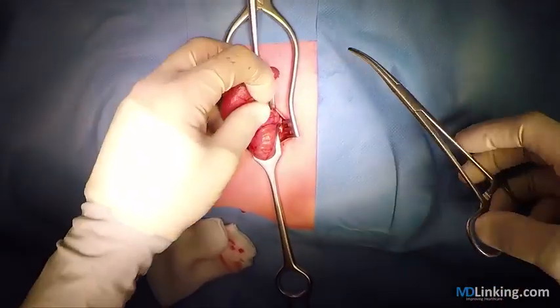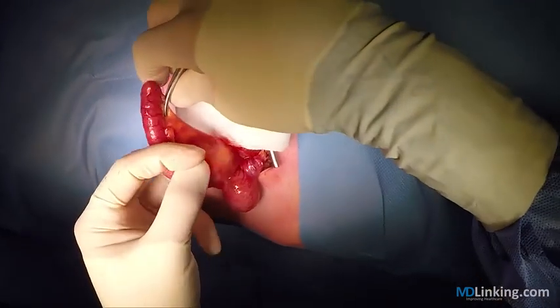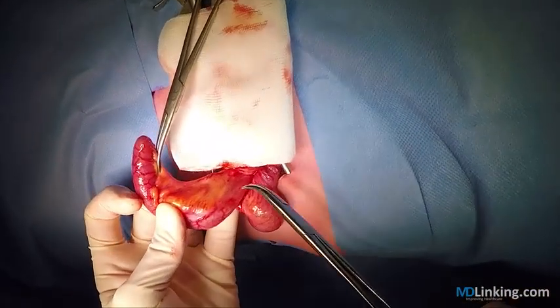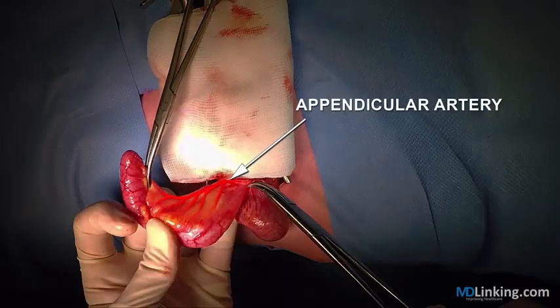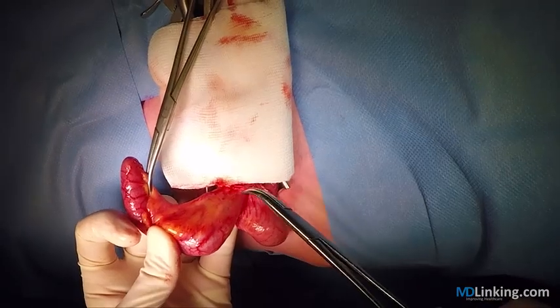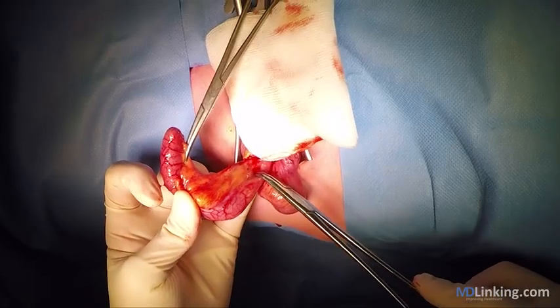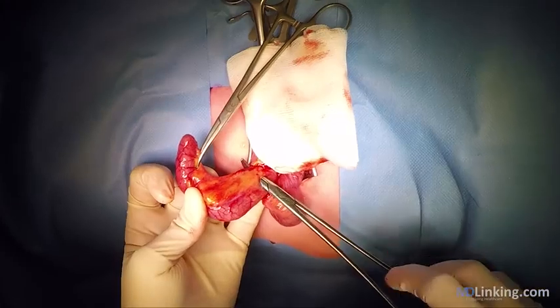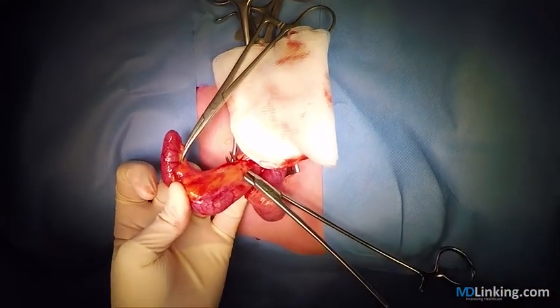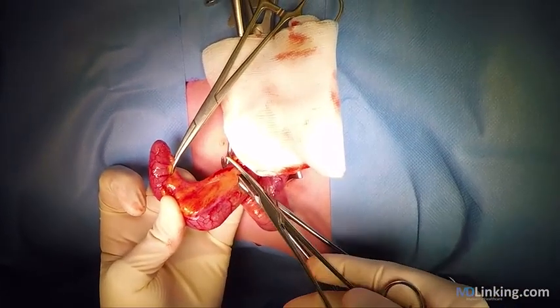and there it is. And we then position a clamp on the distal part of the mesoappendix and can start identifying the appendicular artery, which you can see here. We try to ligate it at the base so that you only need to have one ligation and can thereby, with only one step, divide the mesoappendix.